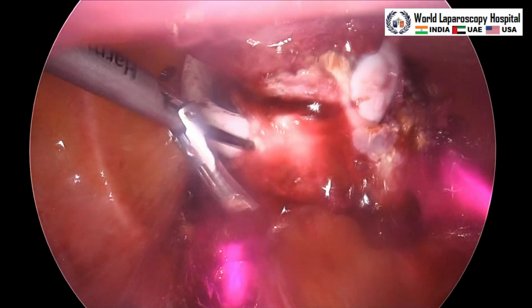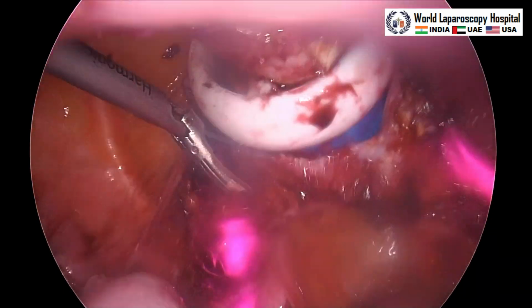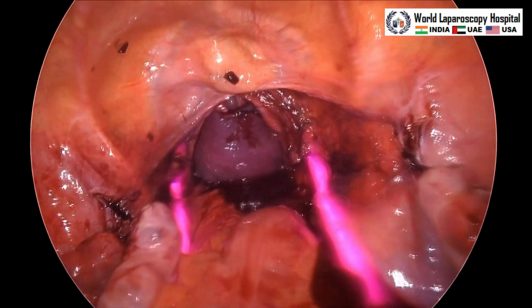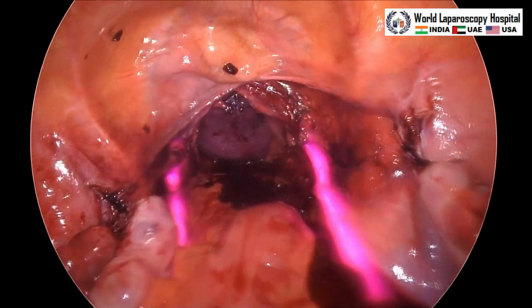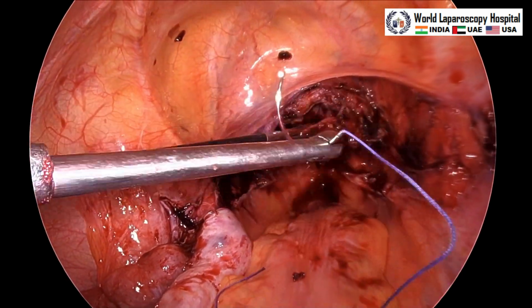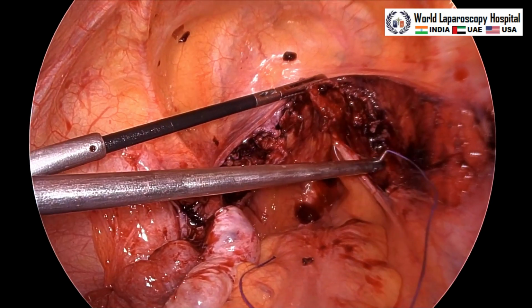So hysterectomy is over, and now the uterus will be pulled out. If you want, you can remove the tube or ovary, it is optional. Some people are not in favor of removing the tube because it increases the devascularization of the ovary, but this is up to you.